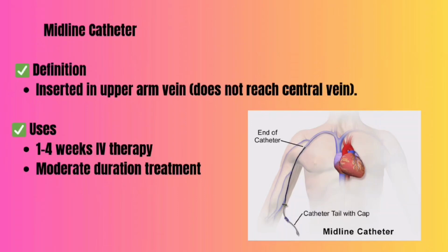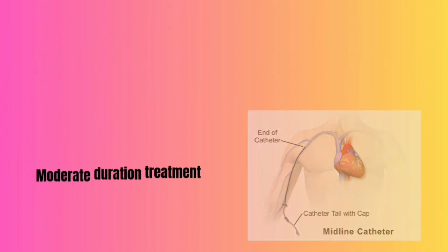We use it for patients who have poor peripheral veins, repeated vein failure, for elderly patients and chronic illness patients.